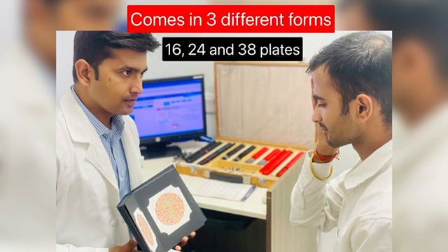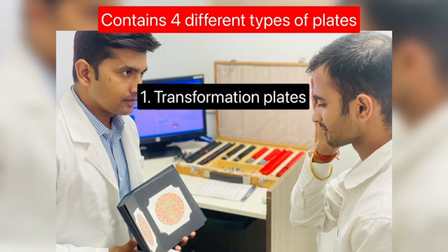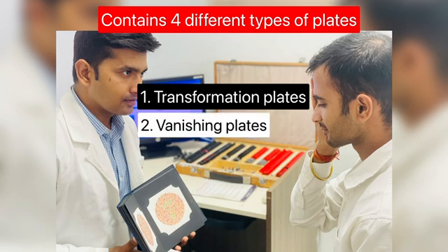This test chart is available in three different forms, which could be 16, 24, or 38 plates. All of these Ishihara test charts contain transformation, vanishing, hidden digit, classification, or diagnostic plates.